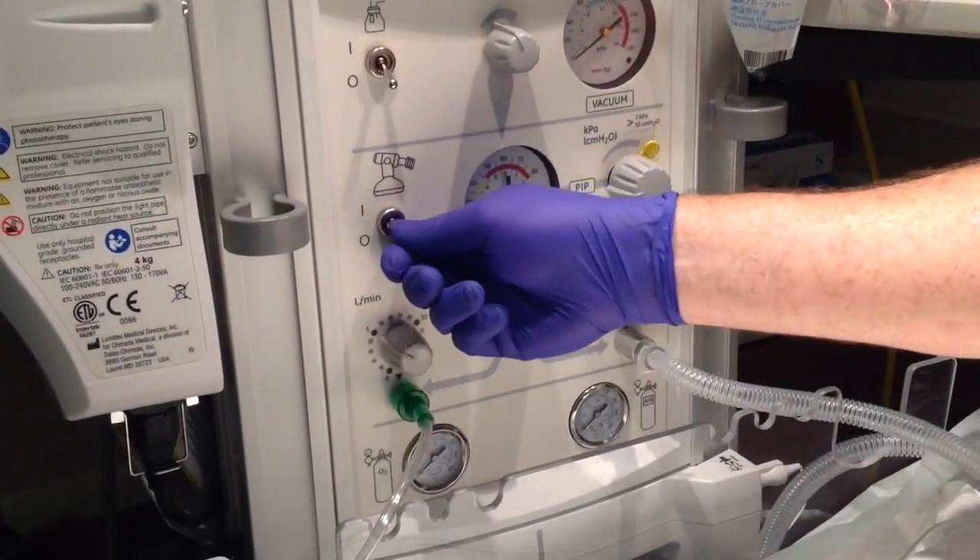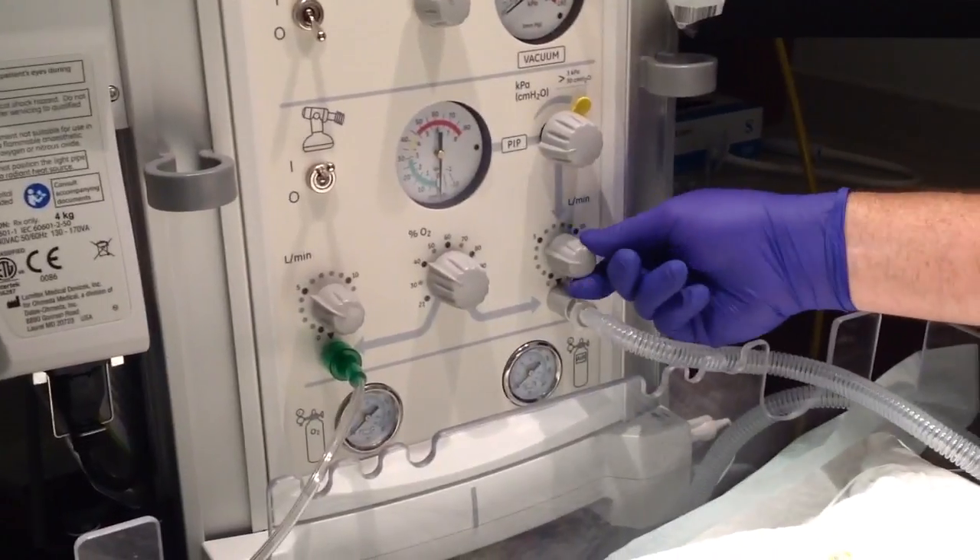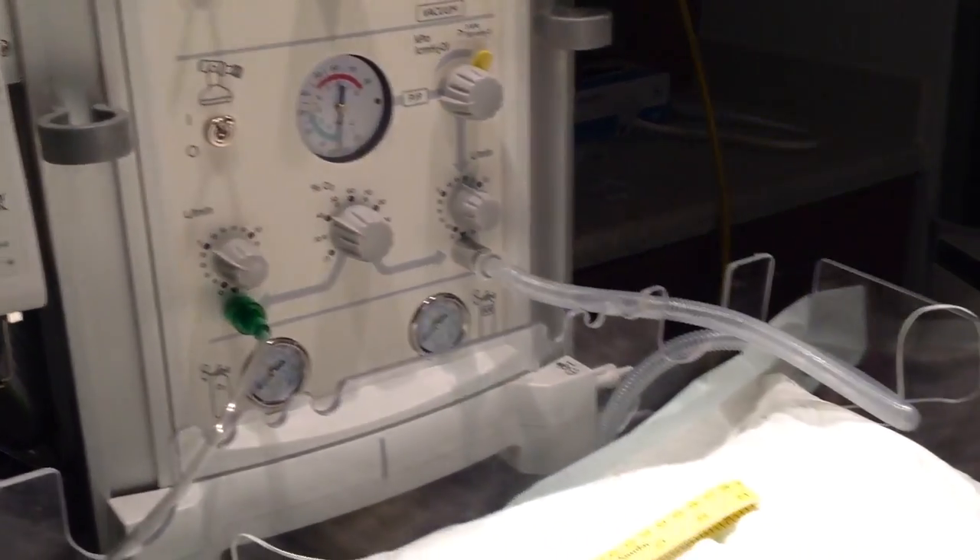The first thing you want to do is turn on the flow to the giraffe bed. You want to adjust your FiO2 to around 40 and adjust your liter flow to around 8.